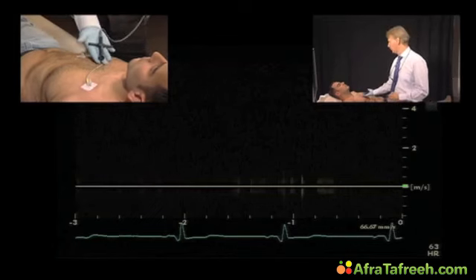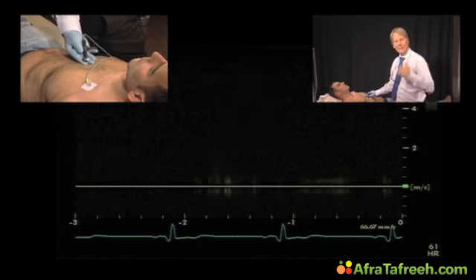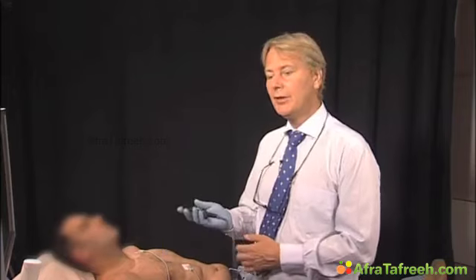To image from a right peristernal approach, we need a so-called pencil probe. The pencil probe has the advantage that the surface is small and it's quite easy to go right in between the intercostal space. However, we do not have a 2D image. To image the patient, we have to put him in a position where he turns to the right as far as possible.